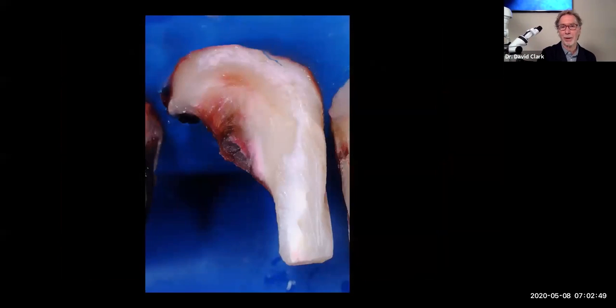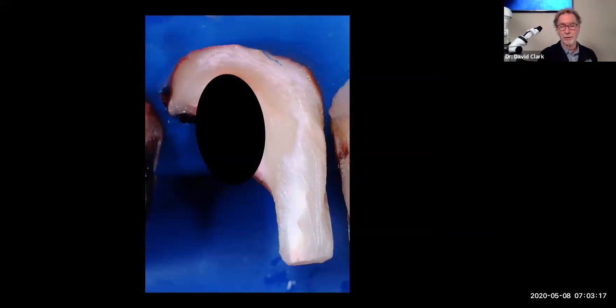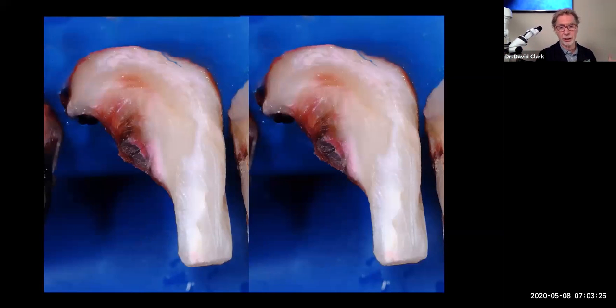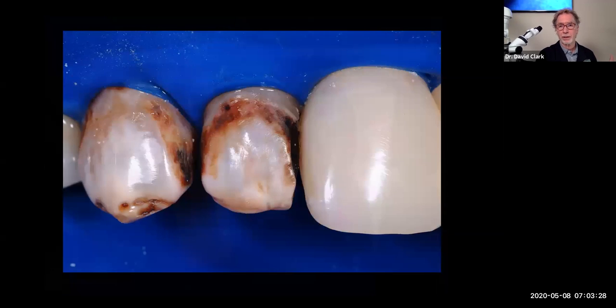And yeah, it's not perfect, but here's the thing. This was my cavity prep to do injection overmolding. There's my selective caries retention. Everything else was just mush or old composite. You see that little spike of enamel? I can shrink wrap that. And here's the cool thing. This dark dentin right here that's actually frank caries, in 5 years, that's going to be rock hard and sterile. Think about that. So we're gonna sterilize it the natural way, okay? But if I do endodontic therapy and take that away and take away all this to do a crown, I got nothing. So on a patient like Josh, doing root canals and crowns makes no sense. But with injection overmolding, it's a different animal.